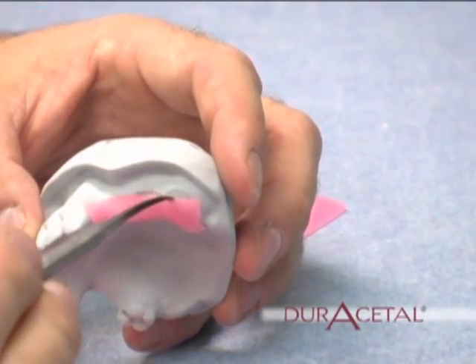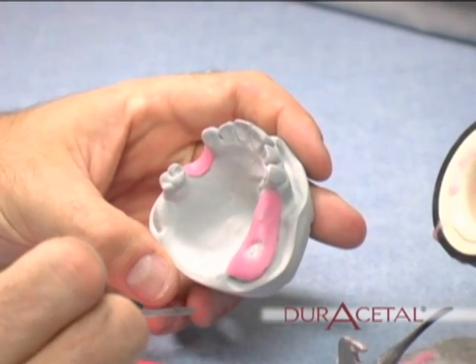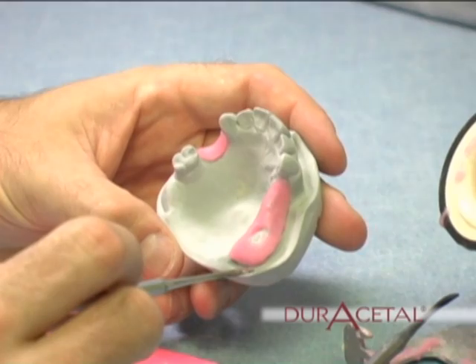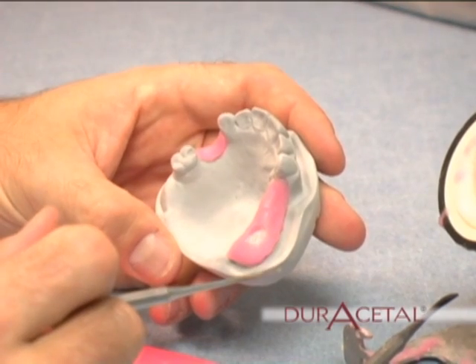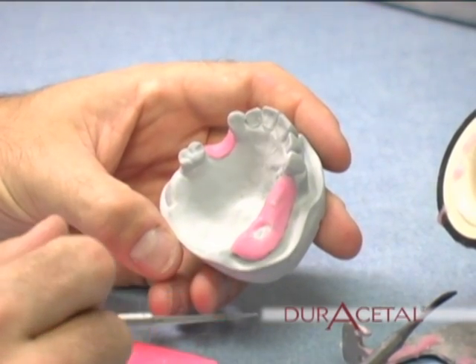Notice the extra large tissue stops cut out of the wax relief. This makes the partial very solid during the frame try-in, which is crucial when dealing with flexible partials. It also makes the frame more solid during the press packing or injecting of the acrylic. At this time, block out any areas of extreme undercut.